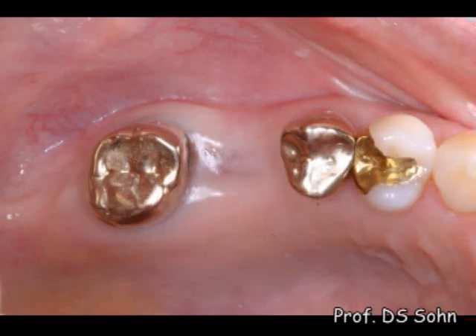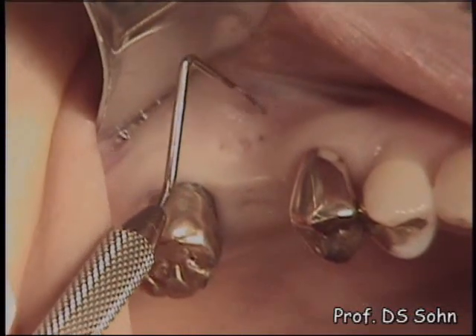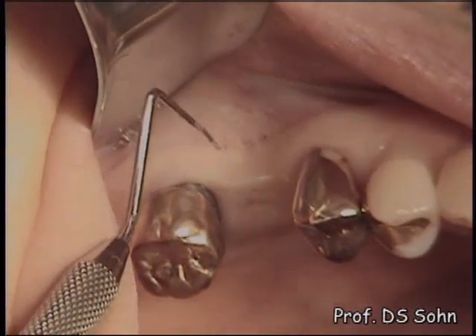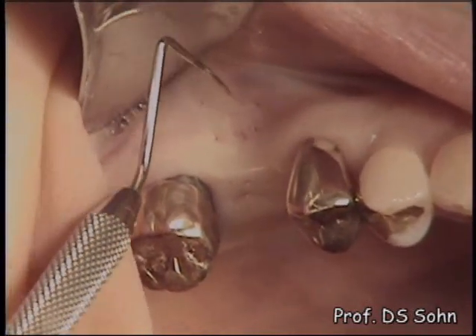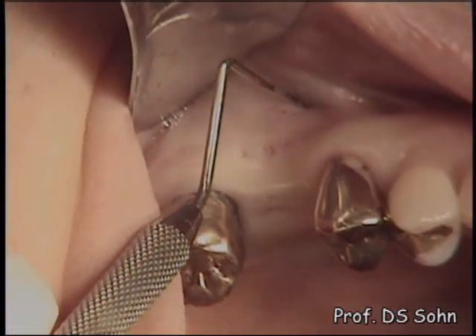The intraoral view shows sufficient attached keratinized gingiva at the implant site, so this case is a good indication for flapless surgery. Bone architecture was confirmed by cone-beam CT, and bone mapping was performed to verify any undercut on the buccal wall of alveolar bone.